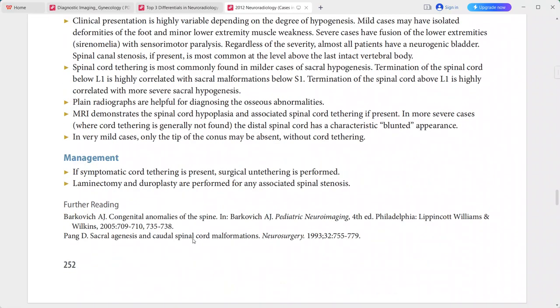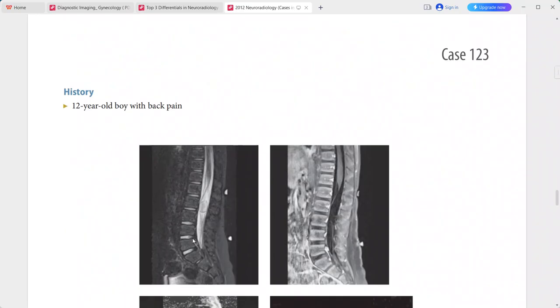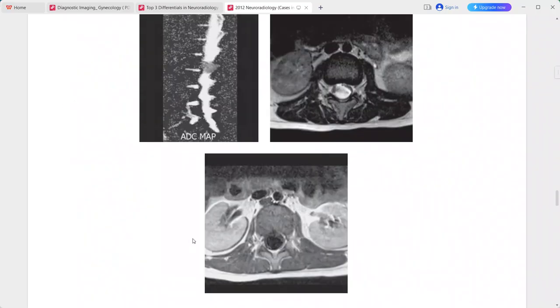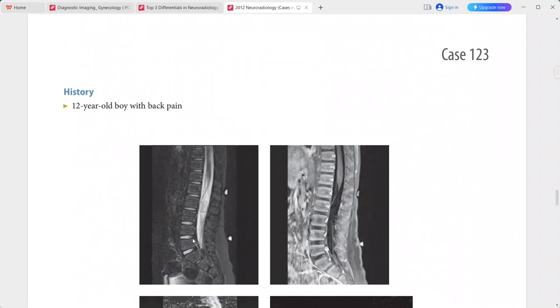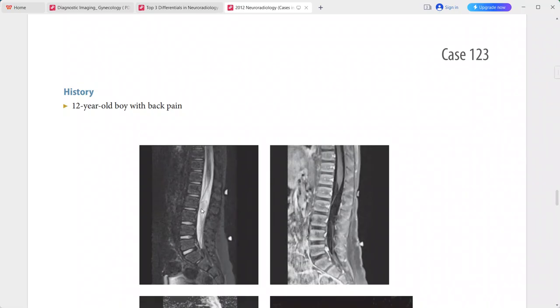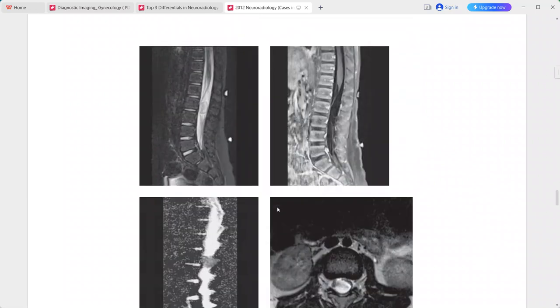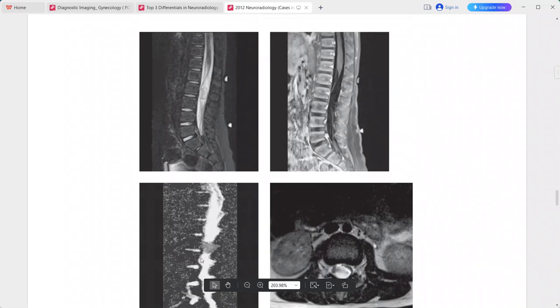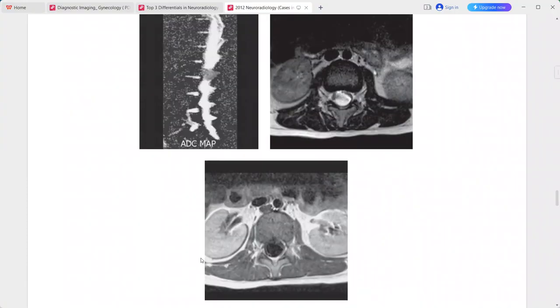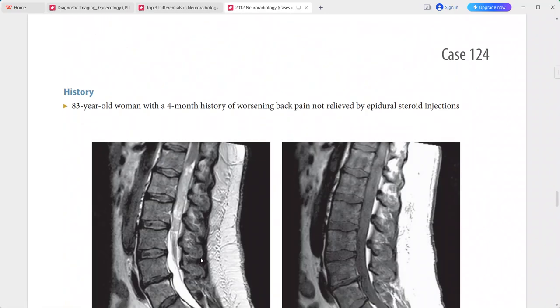In the differentials for caudal regression, you can include tethered spinal cord. Next is a 12-year-old boy presenting with back pain. There is a mass within the spinal canal at L2 that ventrally displaces the nerve roots of the cauda equina. This mass is hypointense to CSF on ADC map, showing diffusion restriction. This is a spinal epidermoid tumor. Differentials include dermoid tumor and arachnoid cyst.